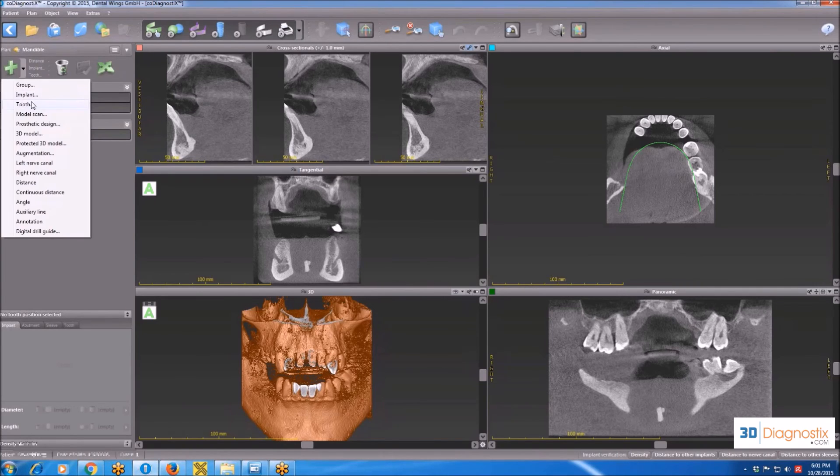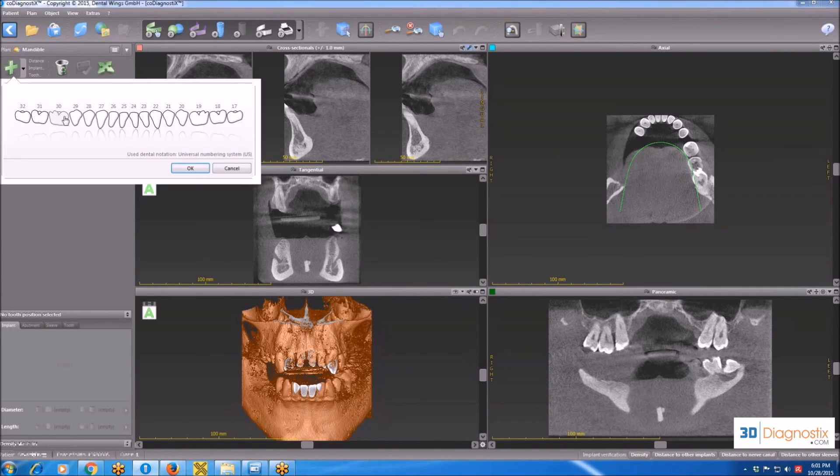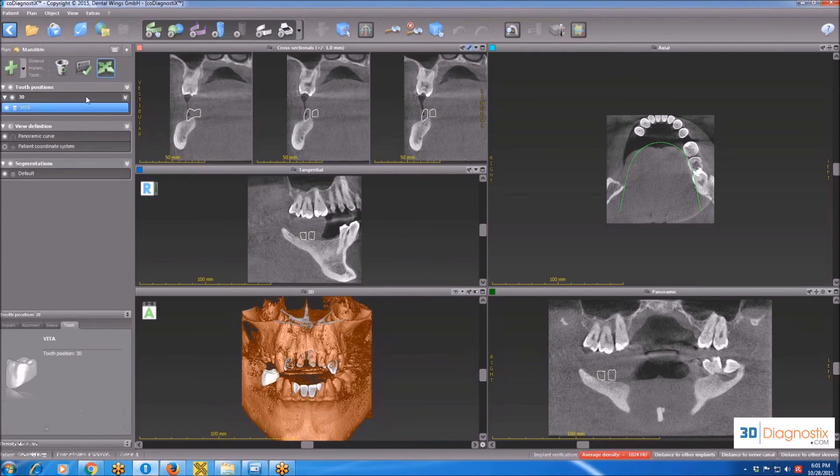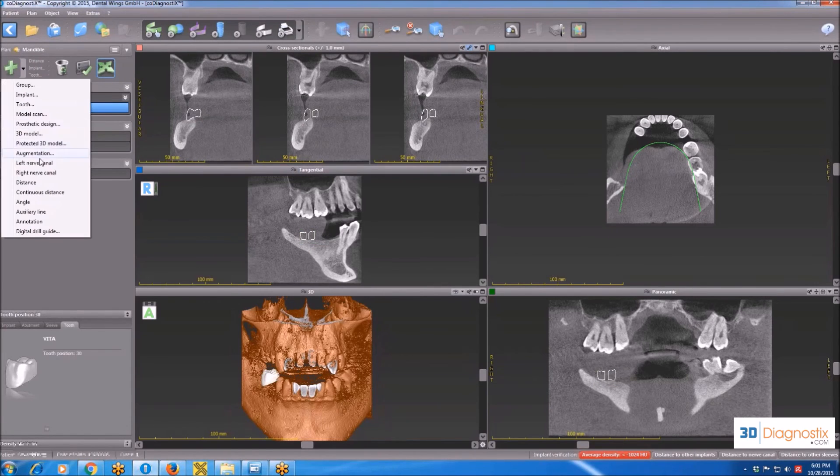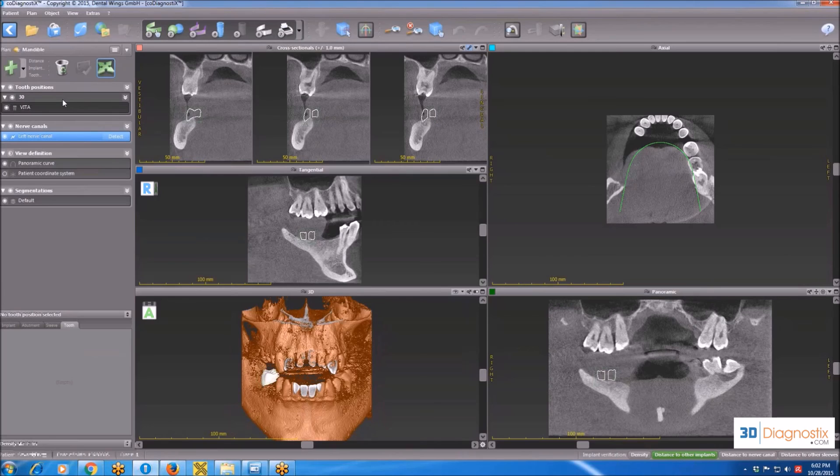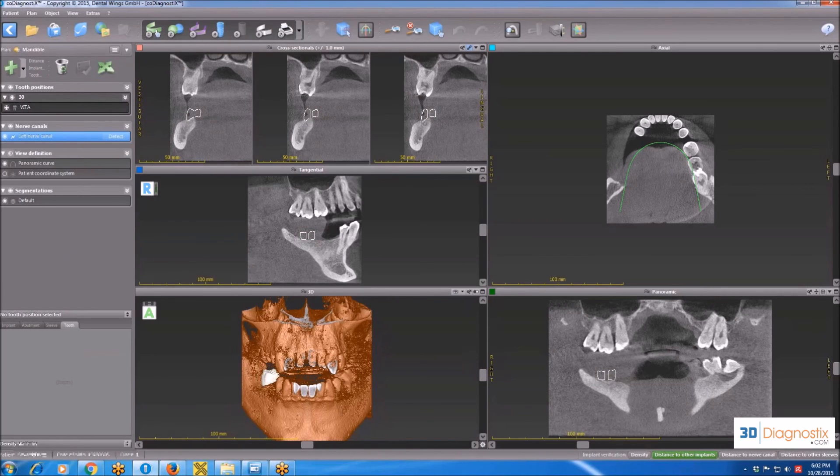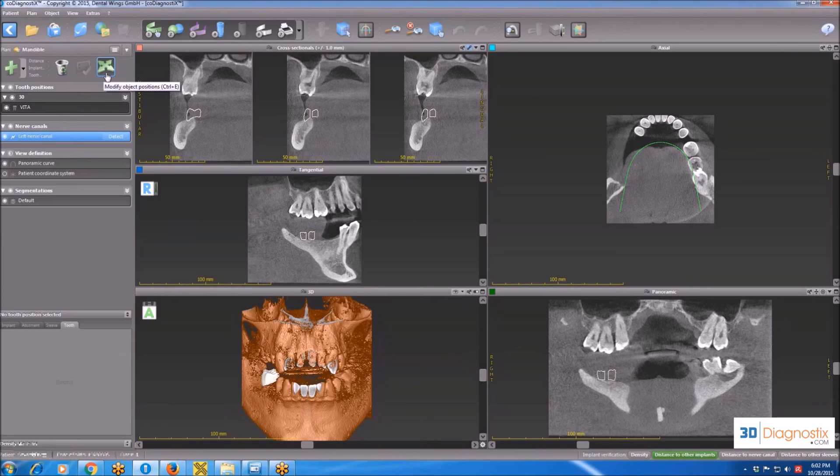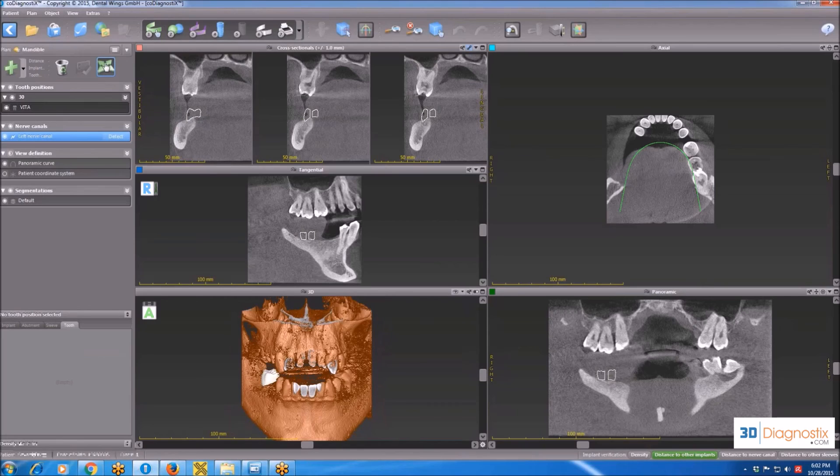If I click on tooth, now I have a list of teeth. If I click on nerve, I'll have a nerve list here. Also on the left panel, there is this modify object position icon that you are going to be using a lot. Whenever you need to move an object, we have to make sure that this button is clicked and highlighted.